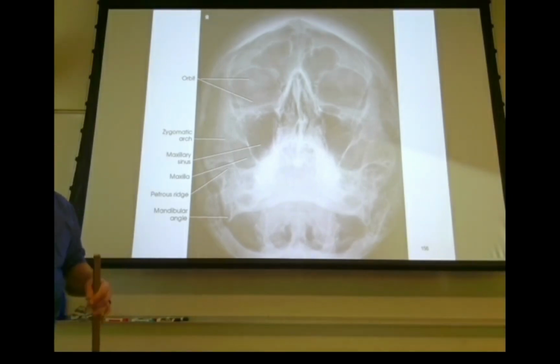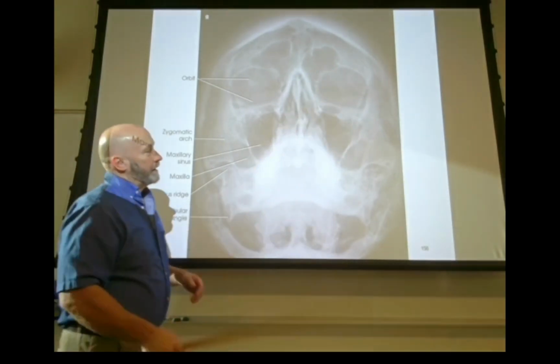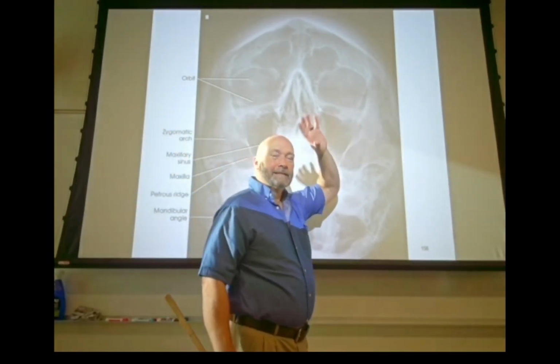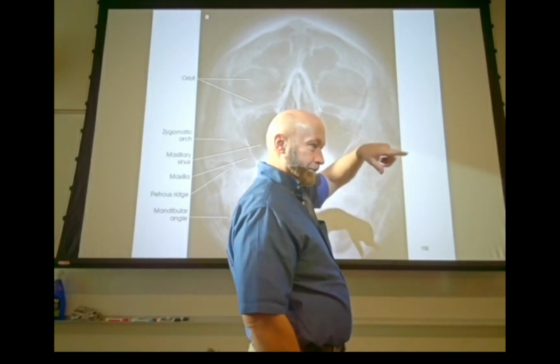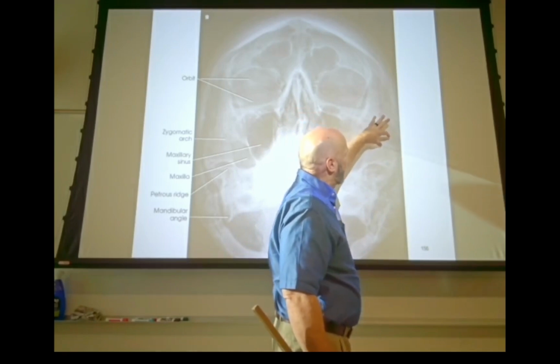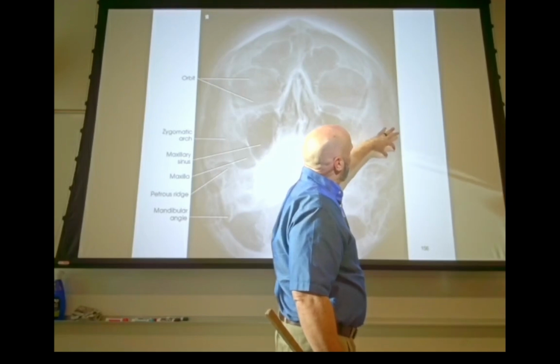Well, we got something here too that we can look at to determine whether or not we've got a good Waters. And that is, we've got this great big flappy looking thing, right? And then we've got, and this is kind of hard to see on this, it will probably show up better in the PowerPoints or if you're looking at the Waters in your book, but you've got this thing that kind of comes down and flattens out right here. So it's kind of a tubular looking thing.